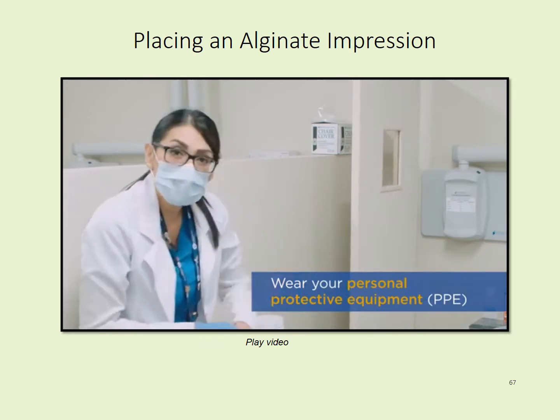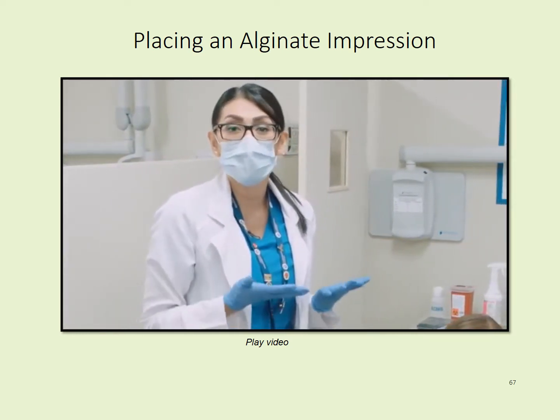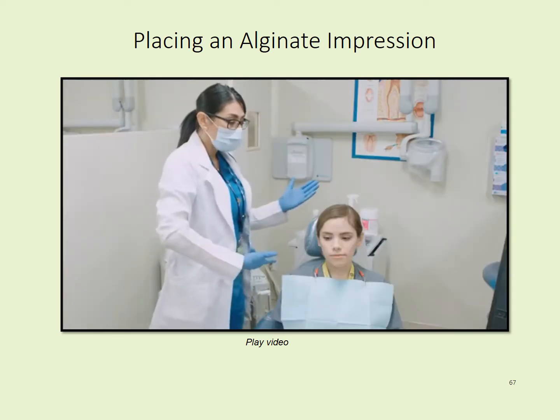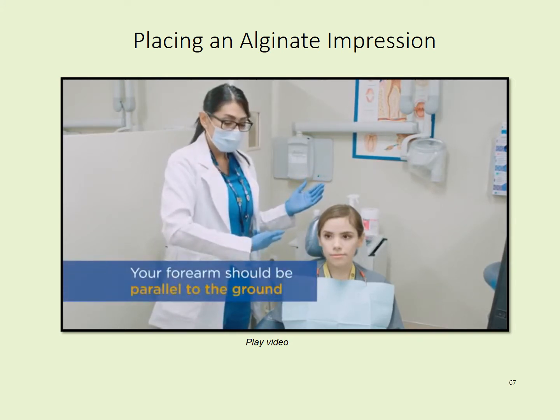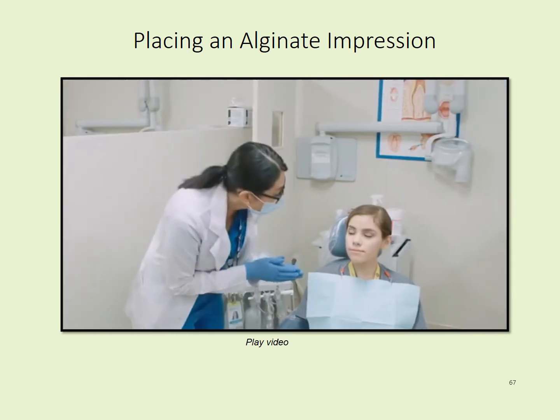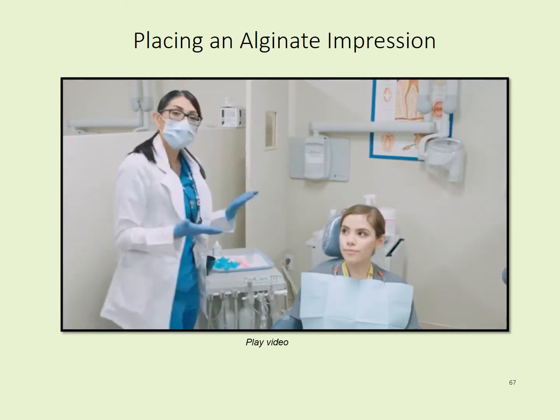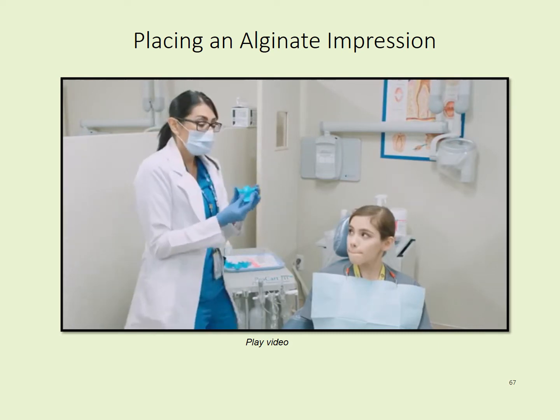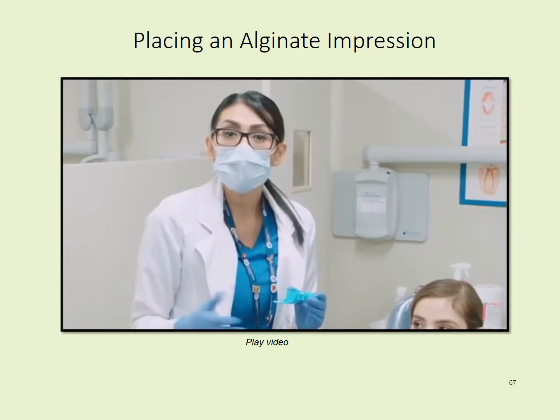When taking an impression, what we want to do most importantly is adjust our patient to the height of us. We want to lift the patient up in the chair. When I'm placing an impression in my patient's mouth, we should be comfortably like this, where our forearms are parallel to the floor. So I'm going to have Heaven open up. Okay. The first thing I'm going to do is, I think she may be a medium. So I'm going to grab my medium tray and place it in the patient's mouth.